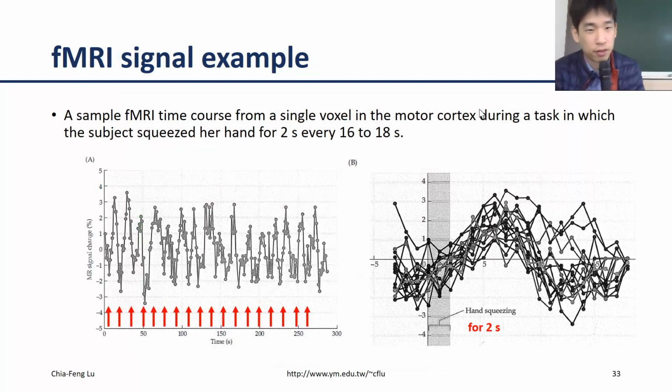So I think this is the final slide. I try to give you an example. This is from one of the studies. Actually, the MRI operator asked the participant to perform finger tapping or something, or hand squeezing. Just squeeze the subject's hand for 2 seconds.